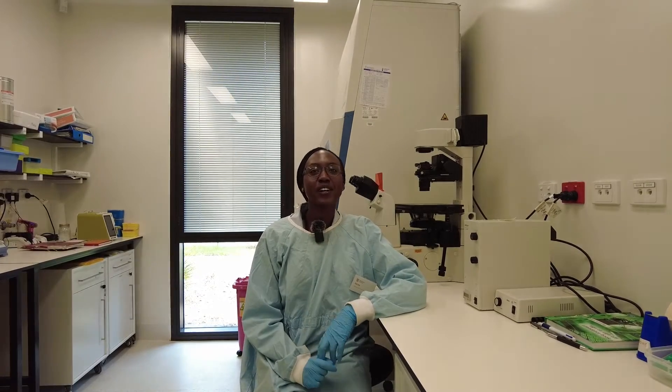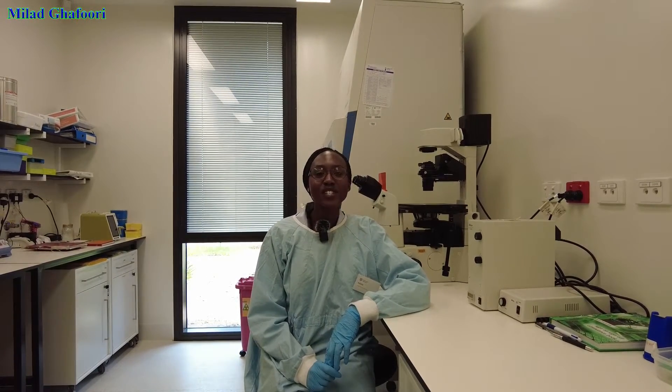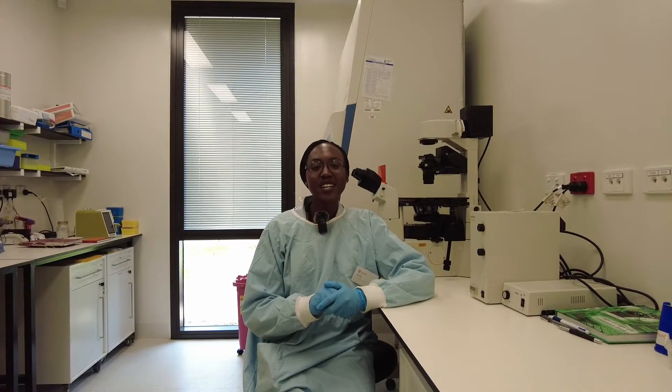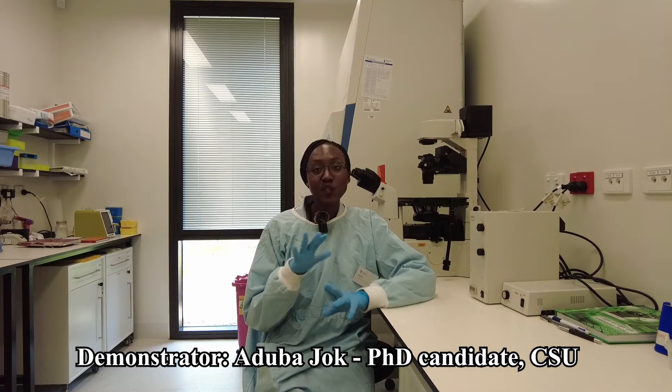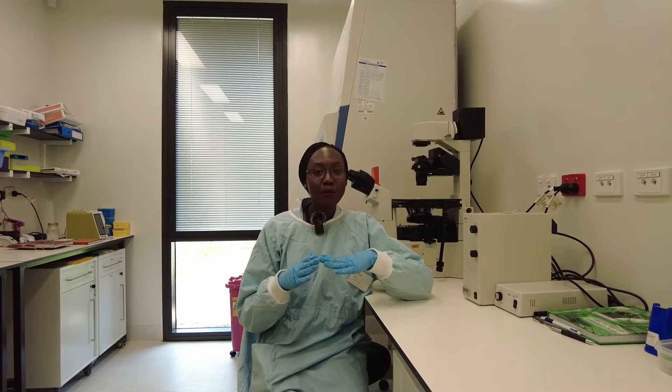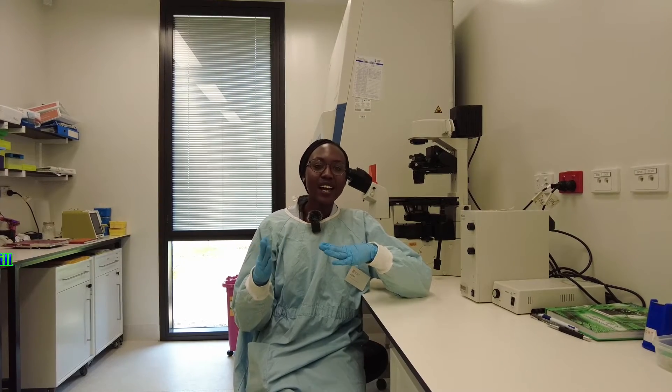Today we're checking our normal colon cells. We put them in the T75 flask and they're growing after being in liquid nitrogen. After checking them, they're about 20% confluence, which means there's still a lot of space for them to grow. Today I'm going to be changing the media and continuing them to grow for a couple more days before we split them to a bigger flask.